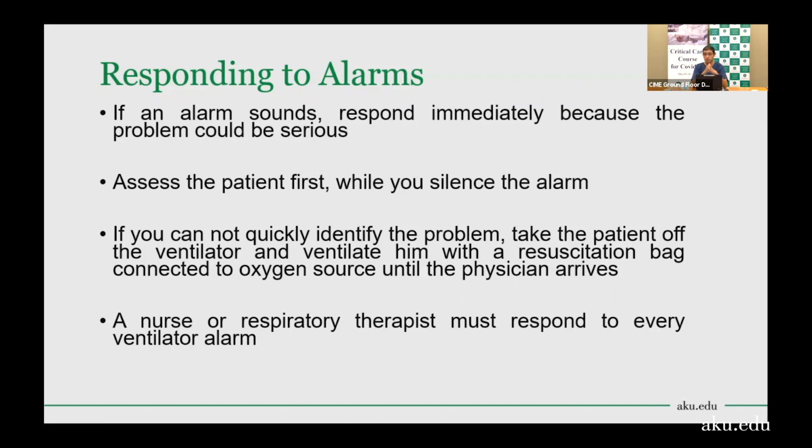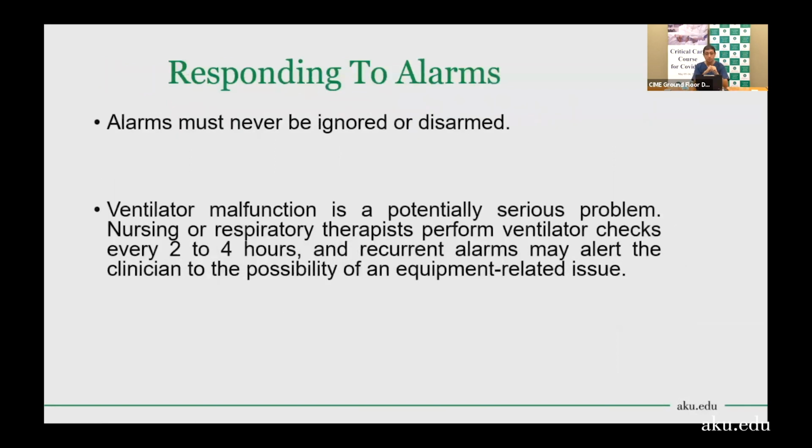A nurse or respiratory therapist must respond to every ventilatory alarm. Everything that alarms must be looked at. It's not, "Let the alarm ring a little, it's okay, it's just an alarm." No, it's not just an alarm. There is a reason that there is an alarm. That means there's something abnormal happening. So alarms must never be ignored or disarmed. Ventilator malfunction is a potentially serious problem. The nurses or respiratory therapists generally perform ventilator checks every 2 to 4 hours.